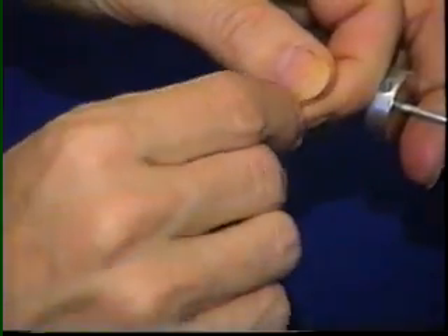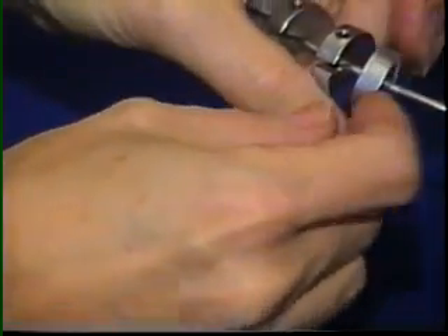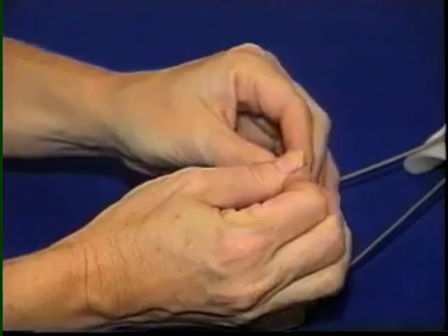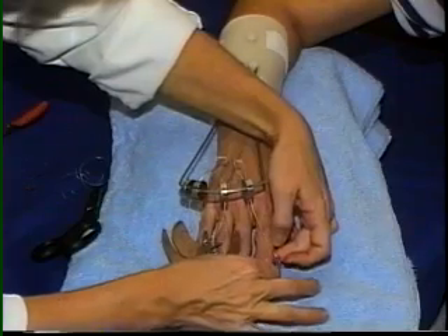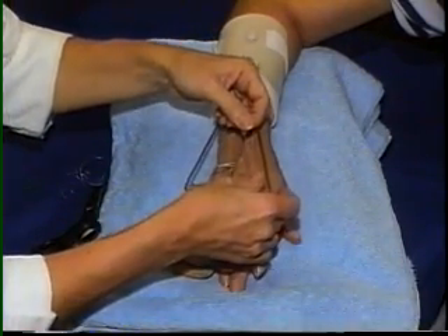The nylon line of each finger cuff is folded at the thinner area to be threaded through the wheel. Then the nylon is creased at the thick portion in order to center the static line which will be attached. A static line, string, or nylon ties each finger loop to the post.